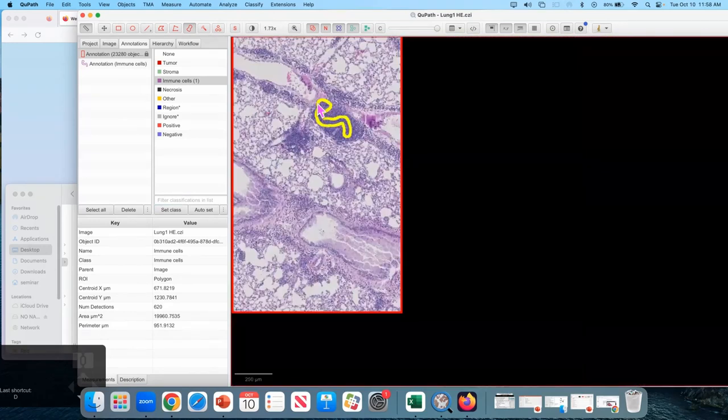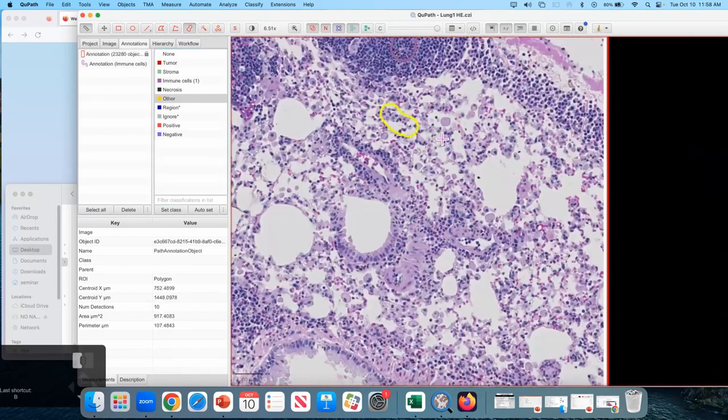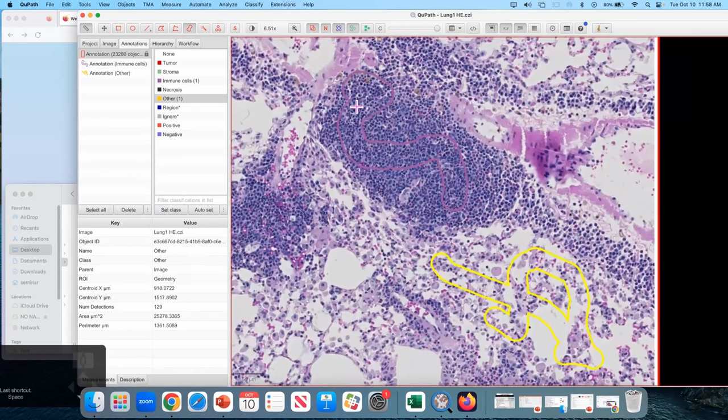I'm also going to draw a shape just over the healthy region here and set that class as other. Is there any chance we got some other cells that are not in the mono, that we classified already as a mono? Can we change the limit of the shape? You can, with the alter option. You can just edit the shape and it will go from there.